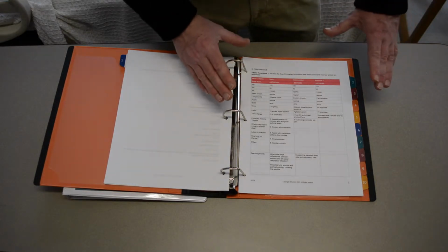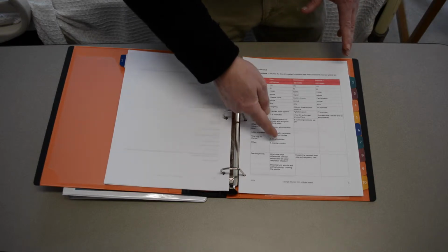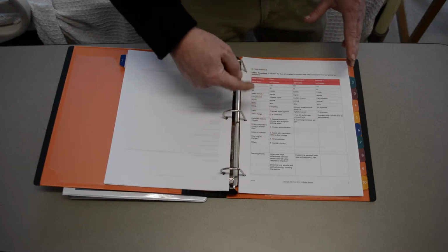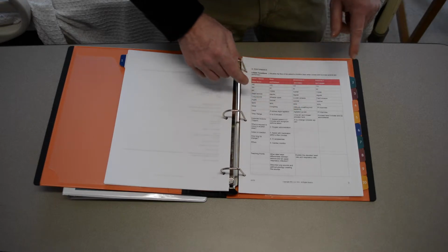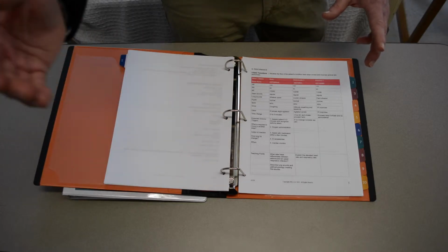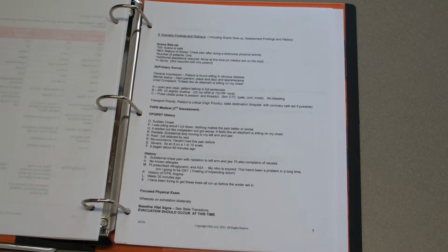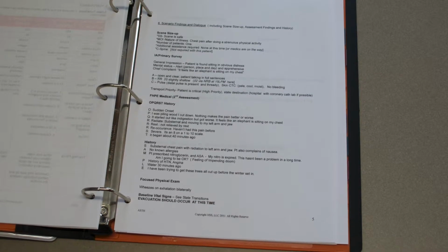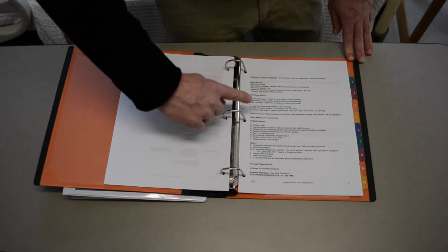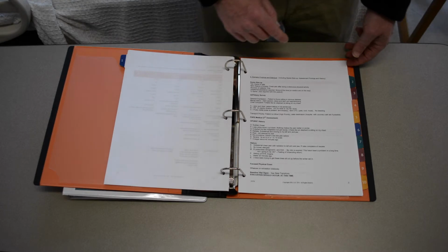Also included on this performance dashboard are the expected actions and triggers by the students, in order, what action an expert clinician would perform, and the time range to stay within each state, as well as sample dialogue for the person who's being the voice of the mannequin. With the EMS scenarios, we've used the format of SAMPLE and OPQRST, where the person being the voice has scripted responses to the most common questions that will be asked.